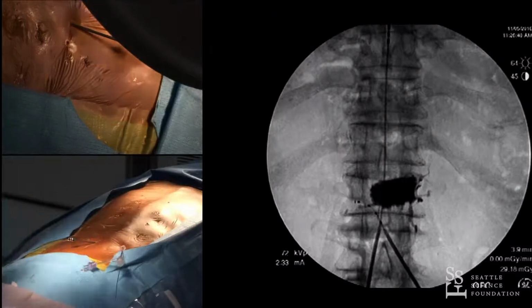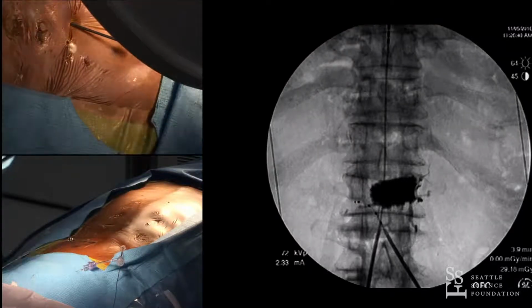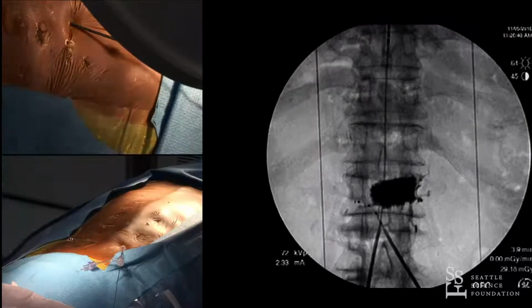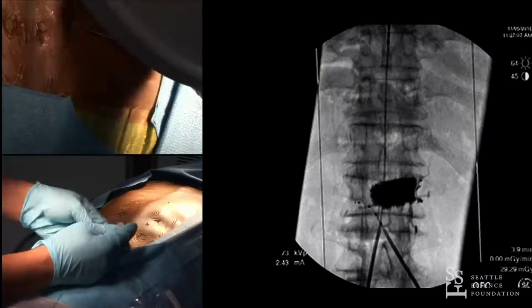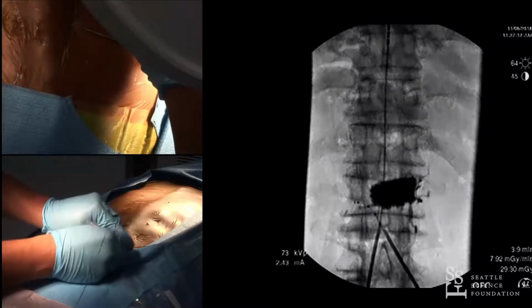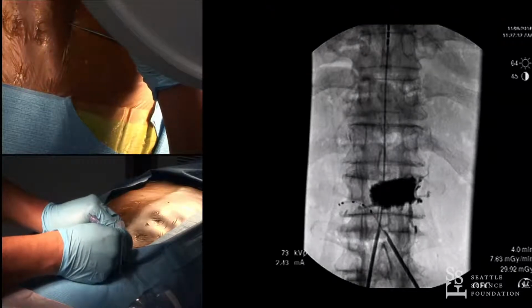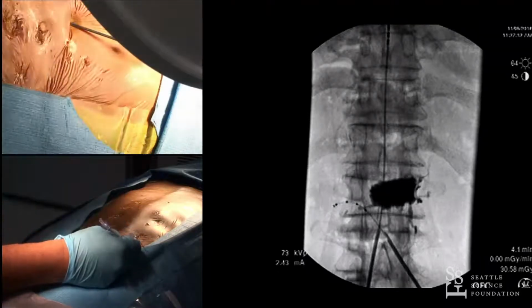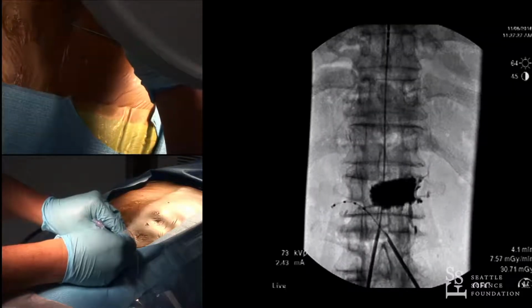Can you collimate for me from the sides? More. Okay. And now, there you go. Straighten up. Good. That's good. All right. And then we'll try to get past that ligament. It comes up to, there we go. Just past another one of those ligaments there. And so we're between the 2nd and 3rd contact there.